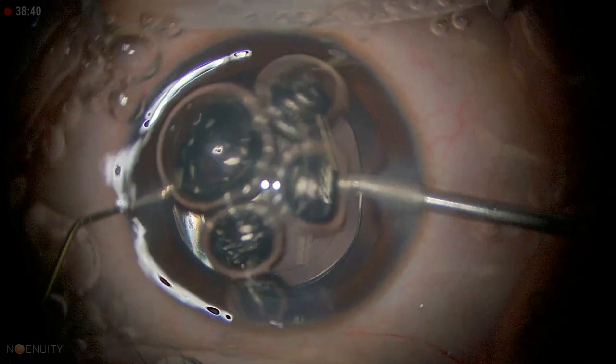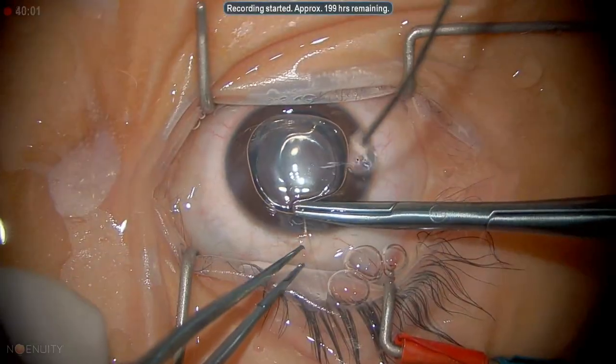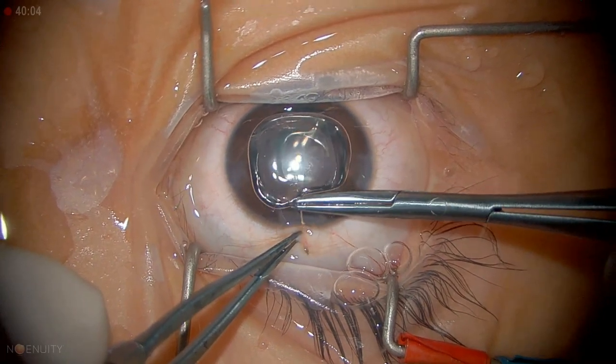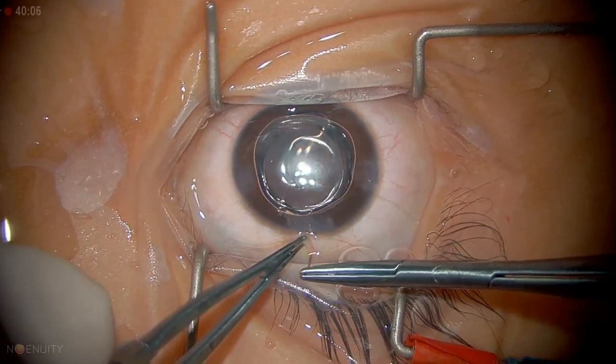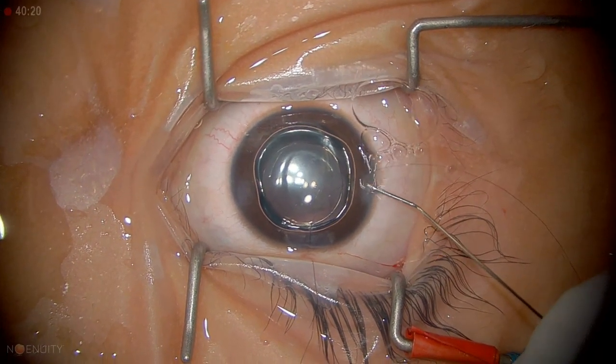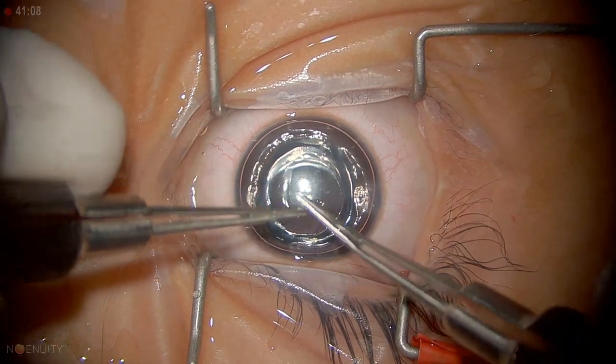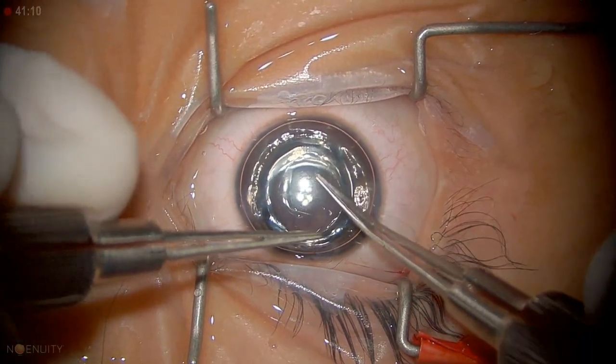I inject air just before suturing. When you are suturing, it should not be full thickness — this is very important. It should be partial thickness, because later when you take out the suture you might enter the anterior chamber and have some risk of infection.